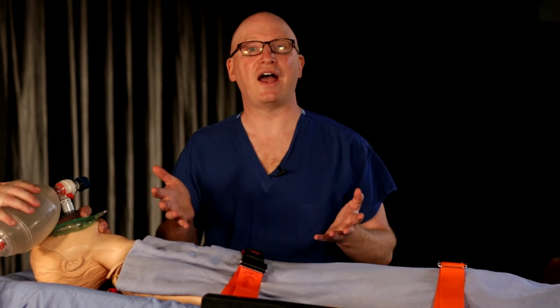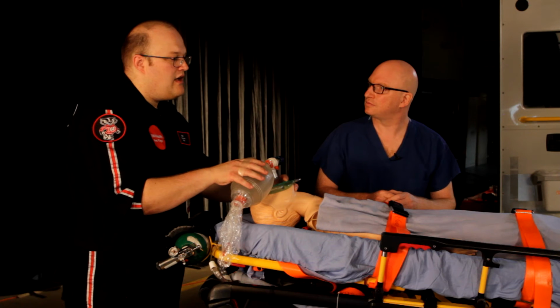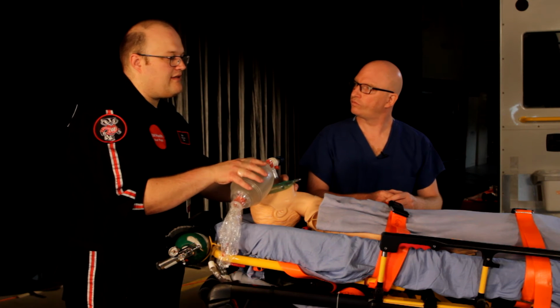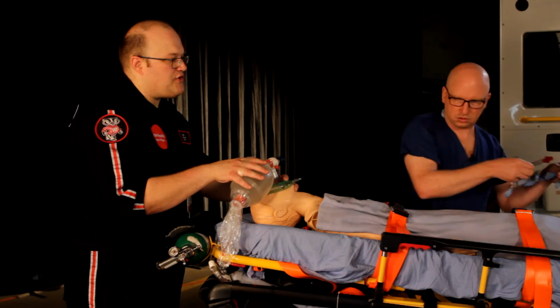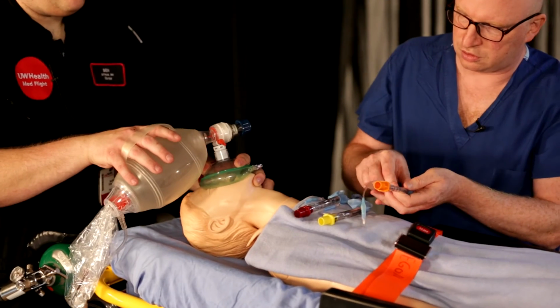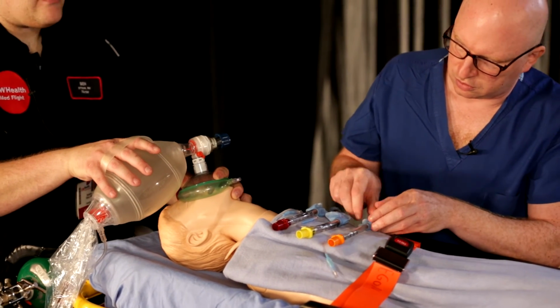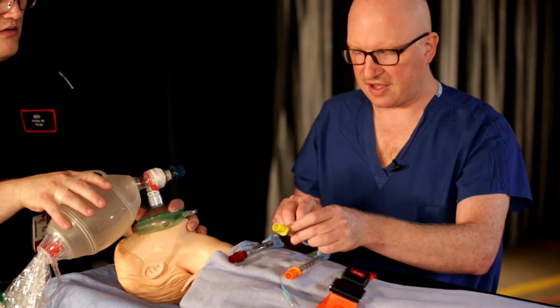All right, now let's talk about how you put a supraglottic airway into a patient and know that it's in the right place. All right, well, let's do the King airway first. So why don't we start with the 3 sizes that we think we're gonna need. The one that I believe in, one size smaller, one size larger if we could. All right. So I think we're gonna need a 3. And so if we can, we're gonna see if there's a port. Is there a port for the OG tube on these tubes, Jonathan? There isn't on this King. This doesn't have an OG port.